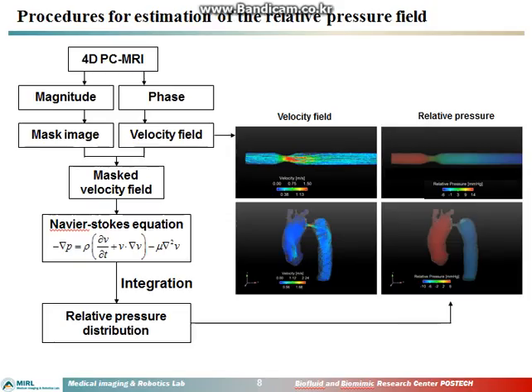Pressure loss of the blood flow indicates the loss of flow energy generated from the heart. The increase of the energy loss results in the decrease of the blood flow or the increase in the workload of the heart for maintaining the same flow rate. Therefore, the pressure gradient is widely used as an important biomarker indicating the severity of stenosis such as aortic valve stenosis or aortic coarctation.